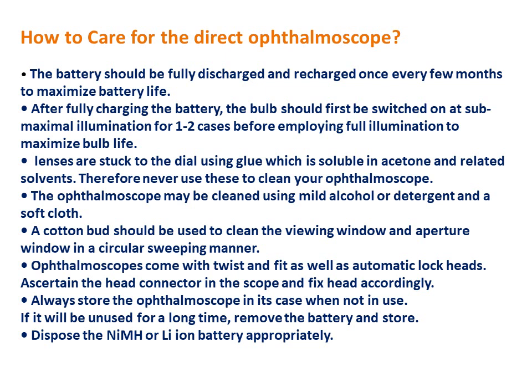and related solvents. So therefore never use these solutions to clean the ophthalmoscope. So what should be used? The ophthalmoscope may be cleaned using mild alcohol or detergent and a soft cloth. A cotton bud should be used to clean the viewing window and aperture window in a circular sweeping manner.